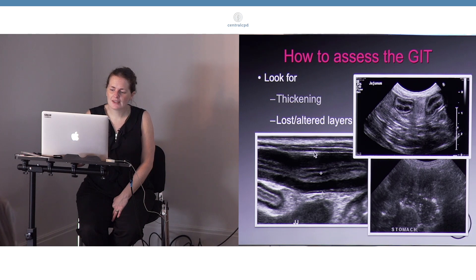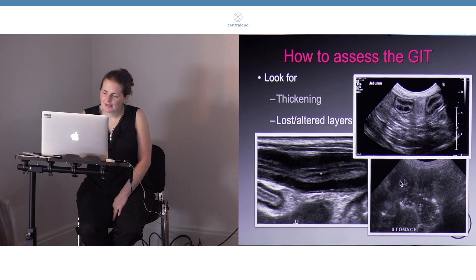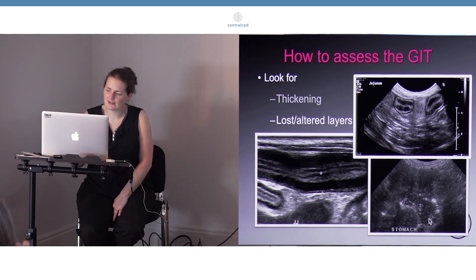We will also actually look at the layering that is present within the bowel. This is a similar piece of bowel compared to the previous slide, and we can see I've put my cursors from here to here to show from the lumen, which is this bit here. There's a little bit of speckled fluid and gesture within the lumen to the other side.